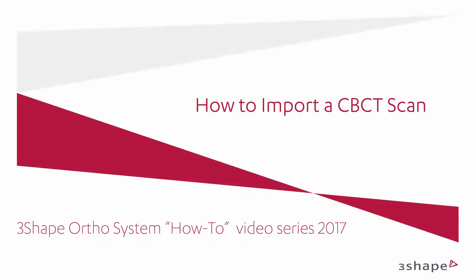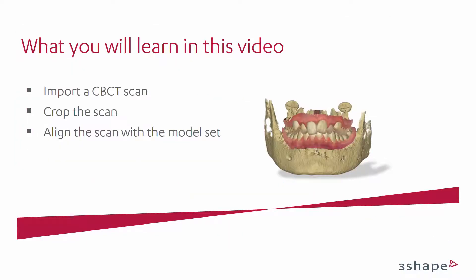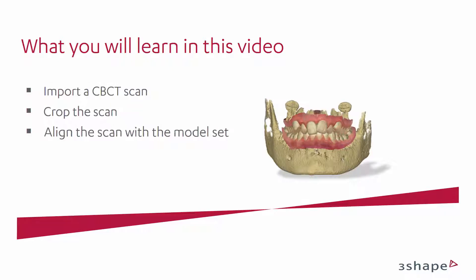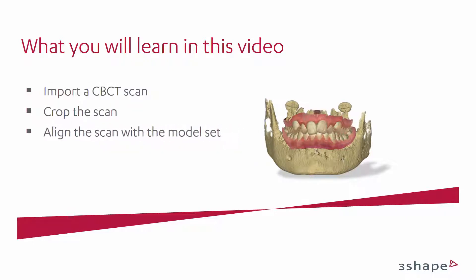In this video you will learn how to import a CBCT scan into OrthoAnalyser. We will show you how to import a scan, crop the scan, and align the scan with the model set.